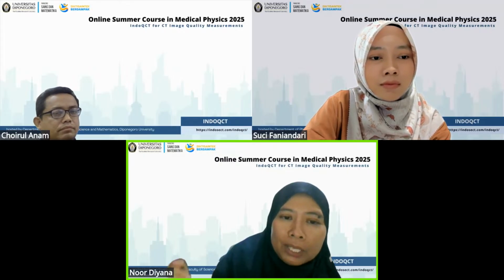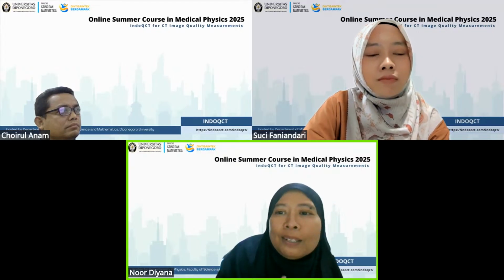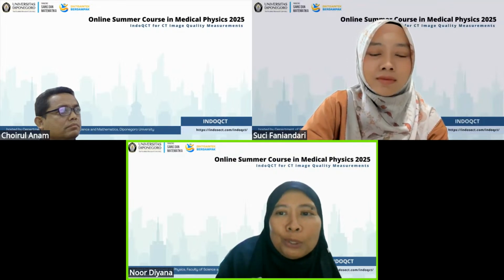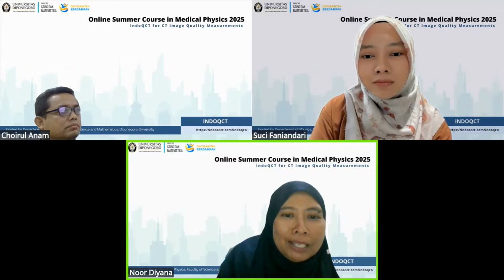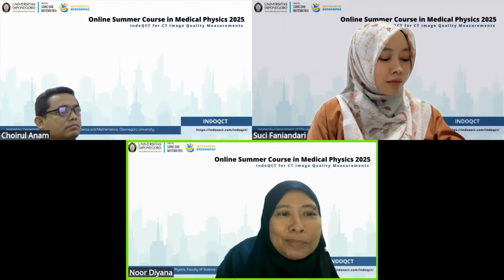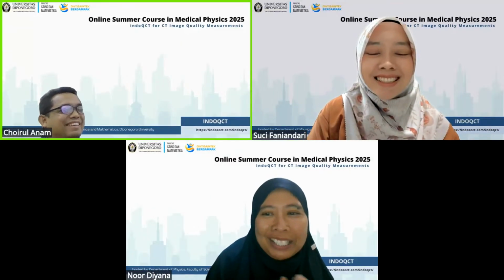You can also use, for MTF, a water phantom because it has the features. Okay, but from my experience, I never explored using patient images, so I'm not really sure. Maybe this part I can ask Dr. Anam, because I never tested it out.